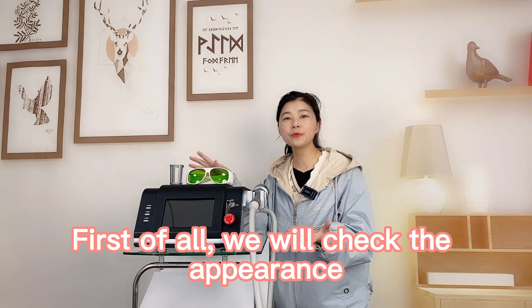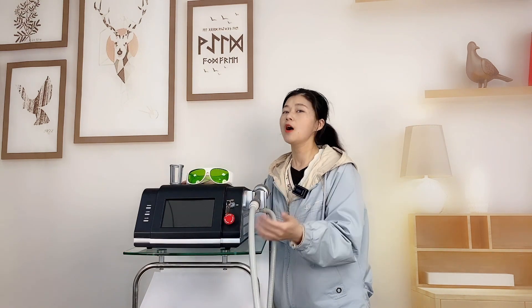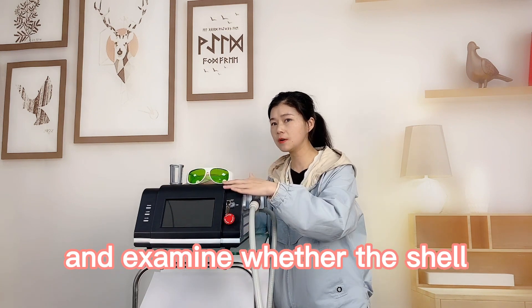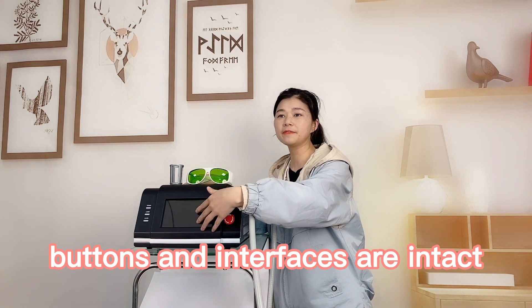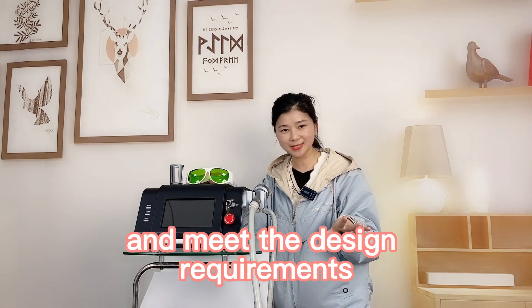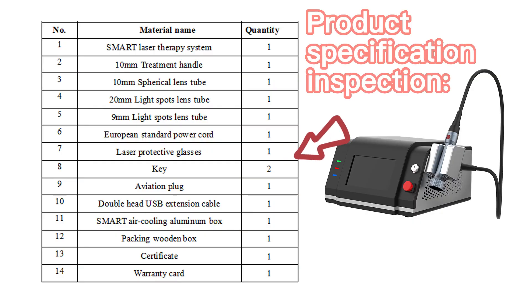First of all, we will check the appearance of the smart laser therapy system and examine whether the buttons and the interfaces are intact and meet the design requirements. Product specification inspection.